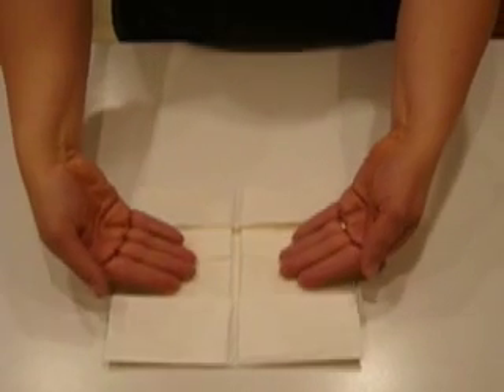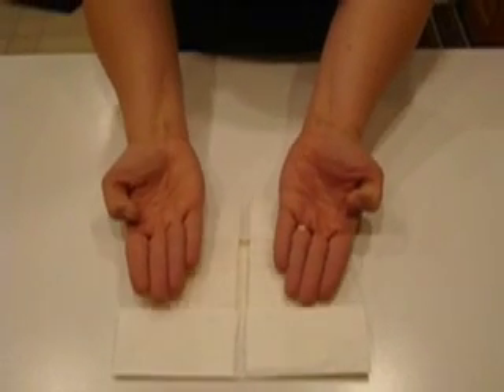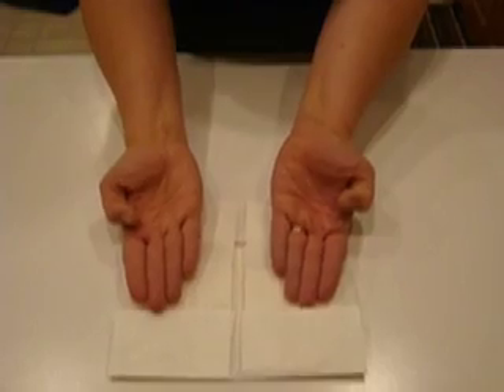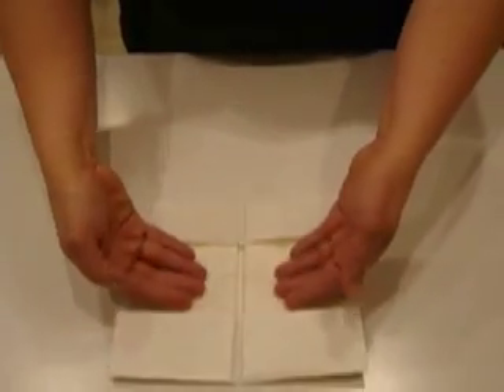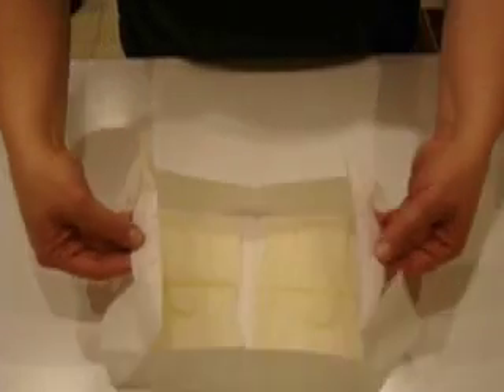When I take my sterile glove package and open it up, my sterile gloves are inside. The outside will be clean, and when I open it is when I'm going to make my sterile field. I come in from the sides — you'll see that there's a left and a right. Some gloves have pictures of hands on the covers. You come in from the side, find the little pull tab, and pull it open.